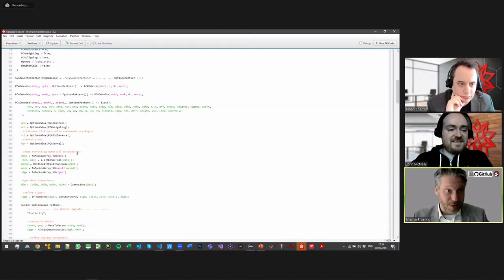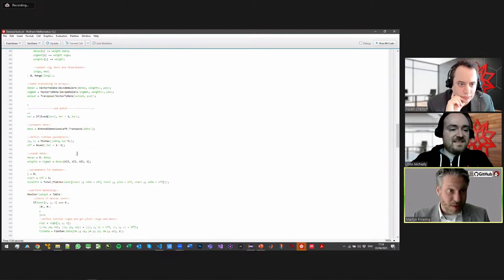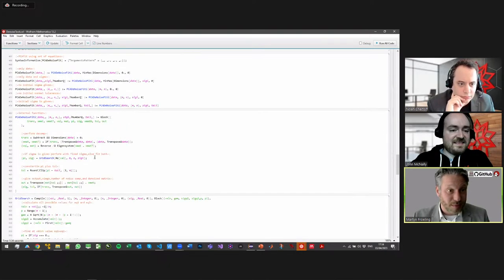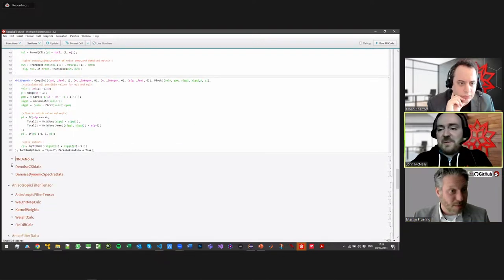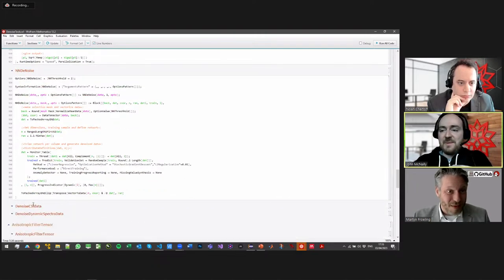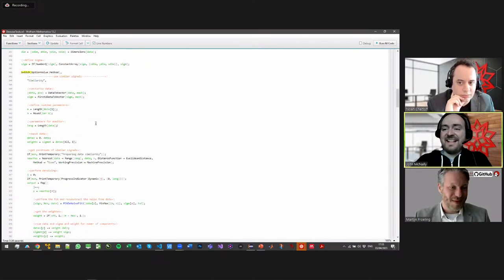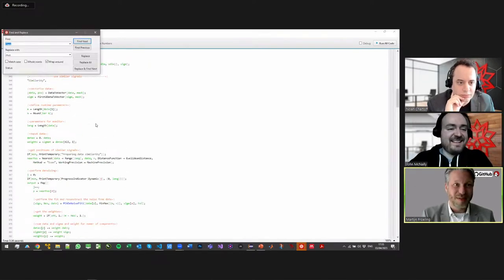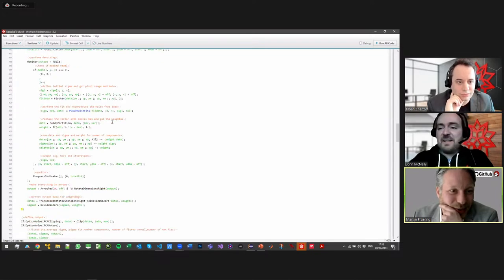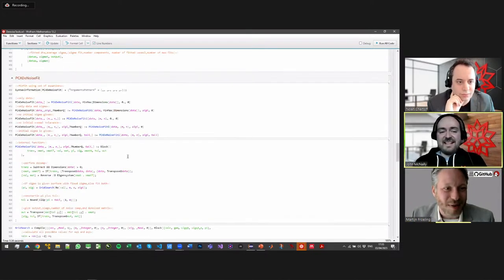So PCA denoise. And then somewhere here, there should be a call to the principal component something. This is also, you're seeing live, the advantage of having high-level functions for things, because you can do this part once, and then the high-level functions take care of that. Let me just see. I've optimized this with low-level functions. It's not doing the principal component. Oh, cool. I realize. So it's actually doing. Yeah, I was curious.